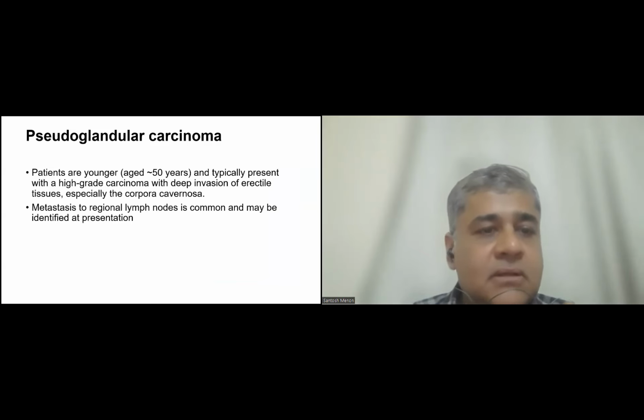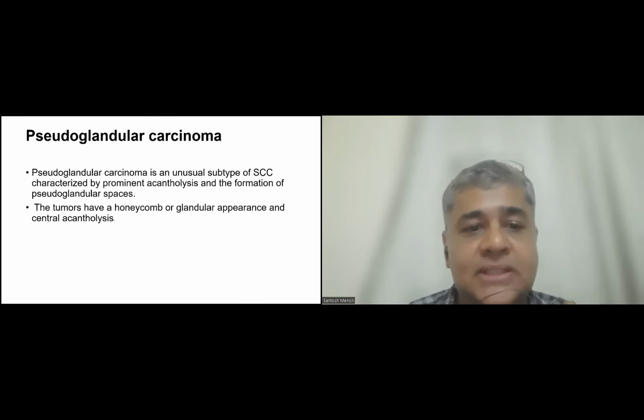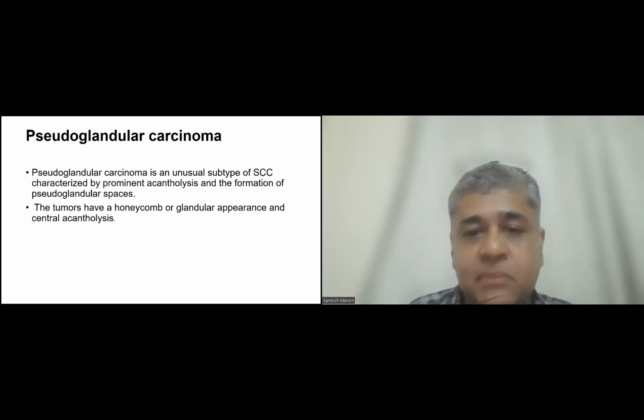Very important again, a subtype is the pseudoglandular carcinoma. Patients are younger, but they are higher grade tumors, and we have to be careful when we diagnose this. The histology is generally characterized by prominent acantholysis. So you have these squamous islands, which look like the usual subtype of squamous carcinoma, but then there is prominent acantholysis, which gives rise to the pseudoglandular spaces.